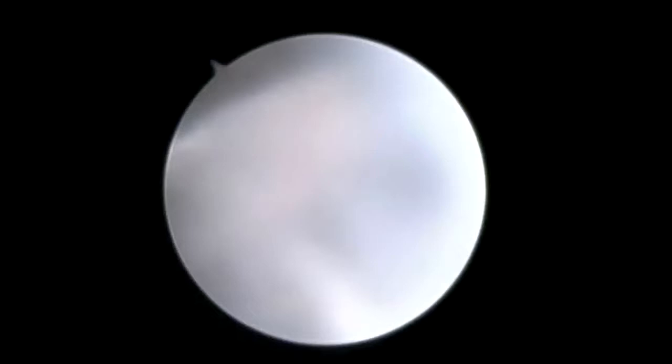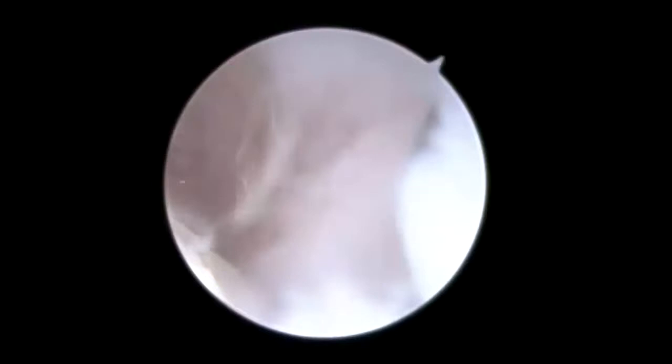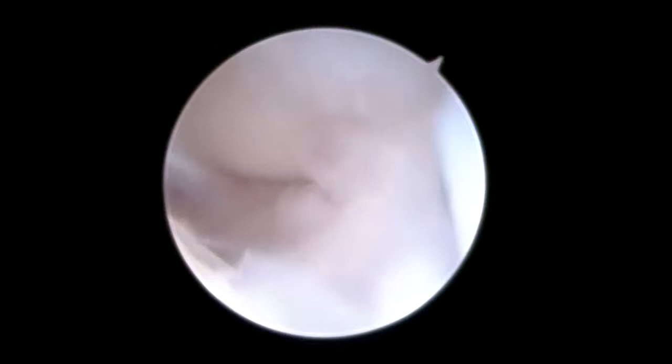Again, a little piece of tissue that is problematic. We'll just remove that with a motorized shaver and clean out the joint. There's quite a lot of enfolded tissue on this side of the joint.